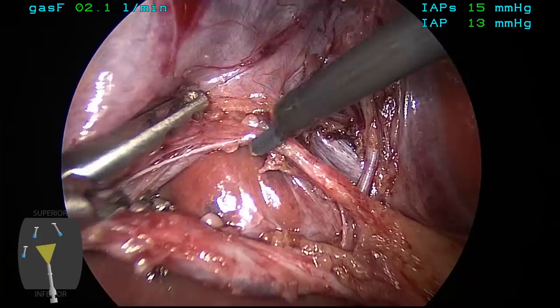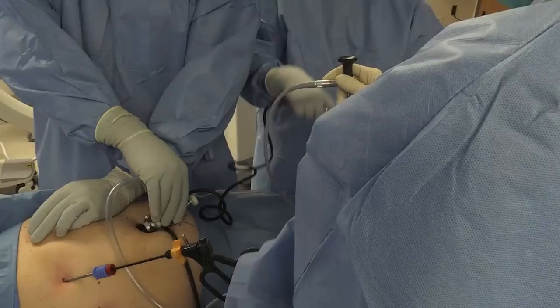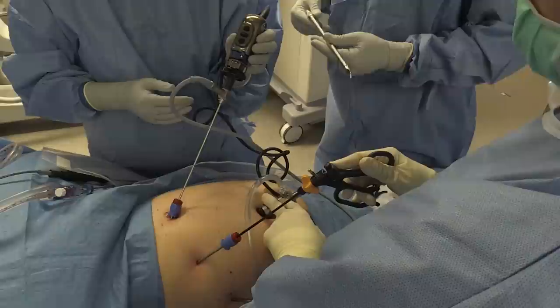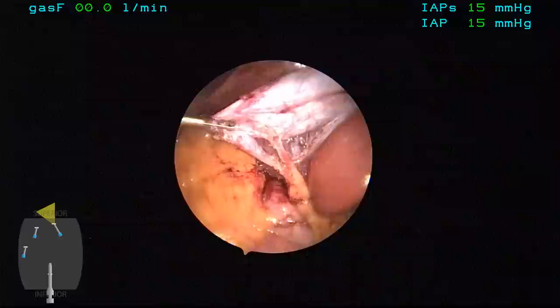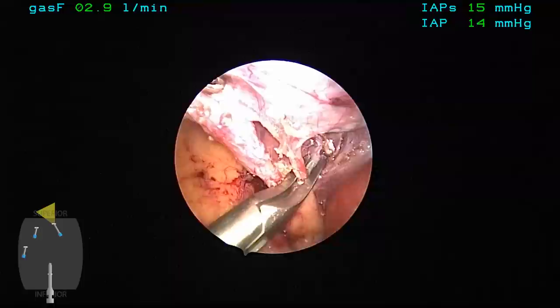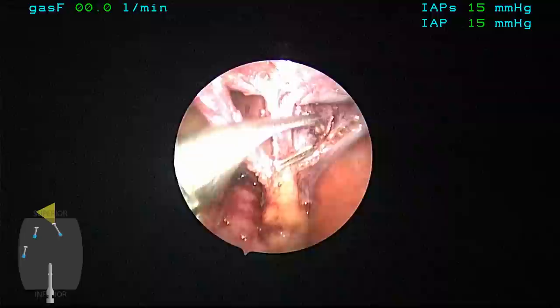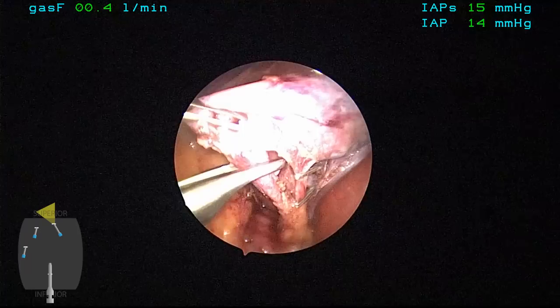All three elements are met. One of the concepts that we like to promote is an intraoperative timeout, which is a stop point or a check after obtaining the critical view to verify by the team members that we have reached this and before clipping or cutting any ductal structures. Because we have used a 3-millimeter port in the epigastrium and we have a 10-millimeter reusable clip-applier, we move our camera port to the epigastric port using a 3-millimeter laparoscopic lens, and then we insert the clip-applier through our umbilical port.